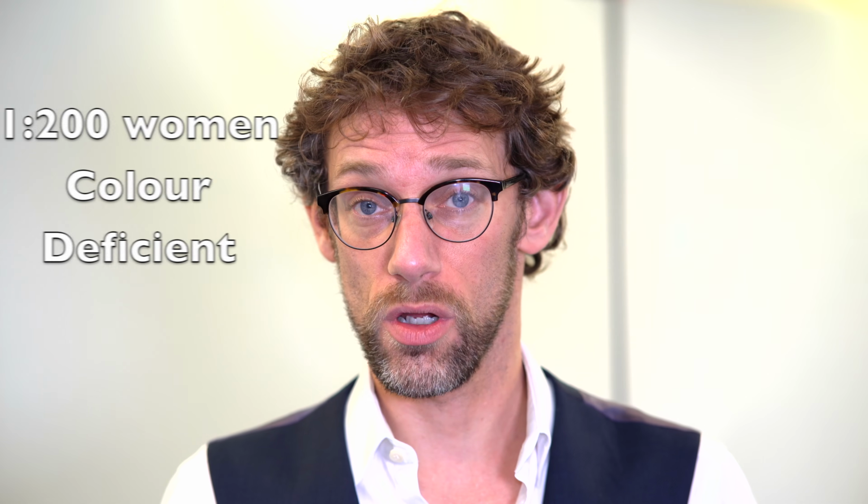Let's put it this way. If the Ishihara chart isn't giving you the answer, then you need to get further help. So to be clear, the Ishihara chart is designed to look at congenital disturbances of colour vision, and that's probably a good place to highlight how common colour vision deficiency is. In chaps, you're looking at about 1 in 12 people affected, whereas in women, because it's an X-linked genetic condition, i.e. women have a backup, it's much rarer. There we're looking at about 1 in 200.